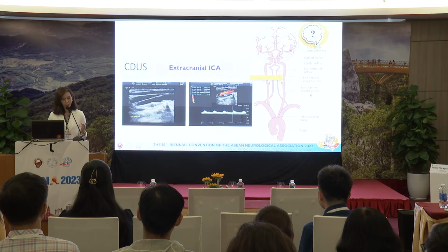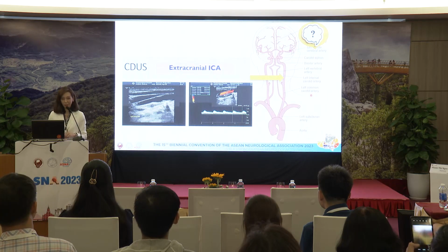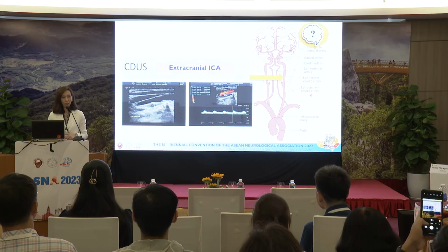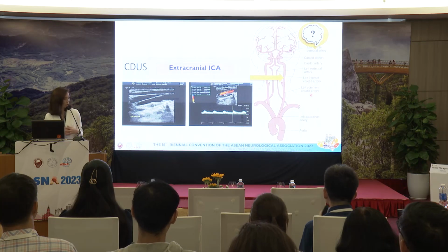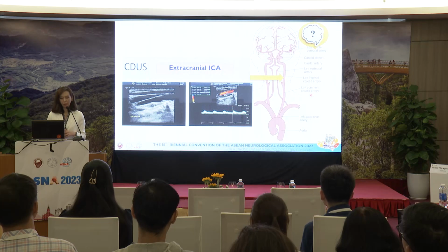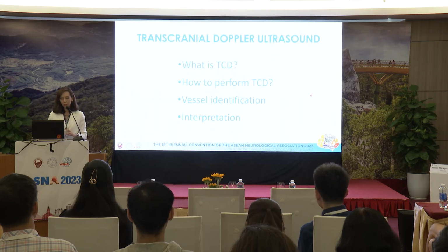We actually looked at the carotid, and Dr. Johanna Kusuma will talk about that later. But we did look at the carotid of this patient, and it shows a mild, small plaque, but no significant stenosis. So the carotid is not the cause of the TIAs. We have to look further at the vascular territory that supplies the MCA, which is the intracranial part. So that's why TCD comes along.